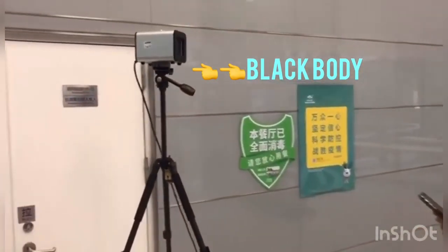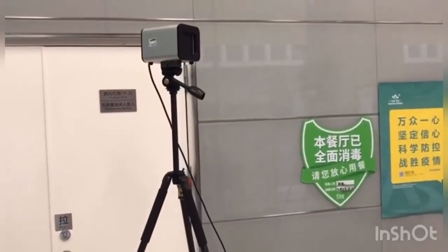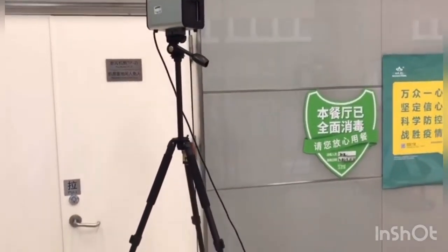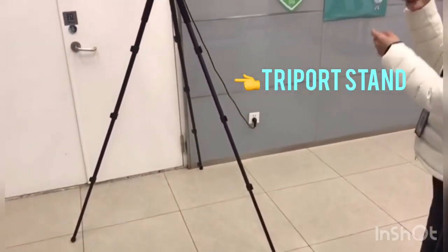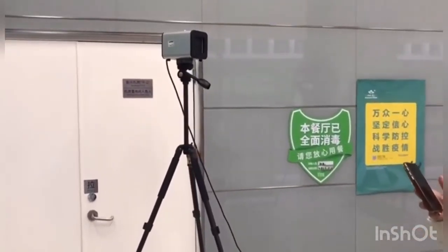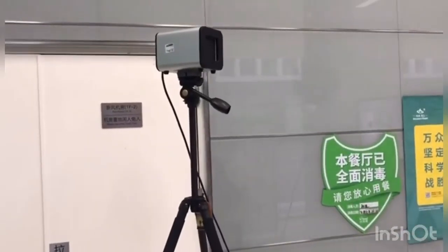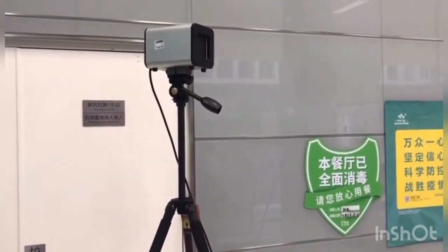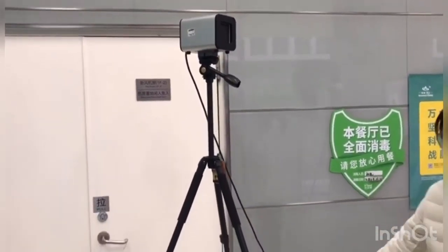First, this is the black body. It's a calibration device and it's a standard temperature source. When the thermometer is used to measure human body temperature, it is greatly affected by environmental factors and needs to be calibrated in real time through the black body. You can see it's fixed on the tripod and it only needs one power line.